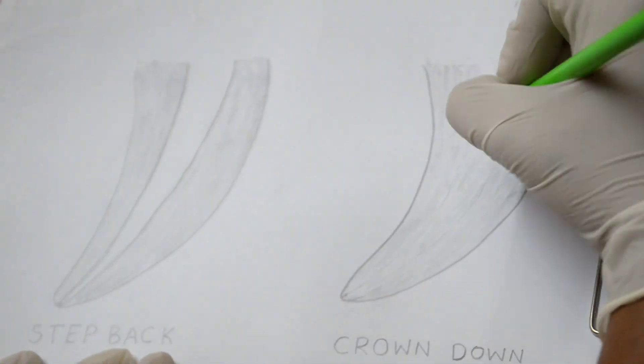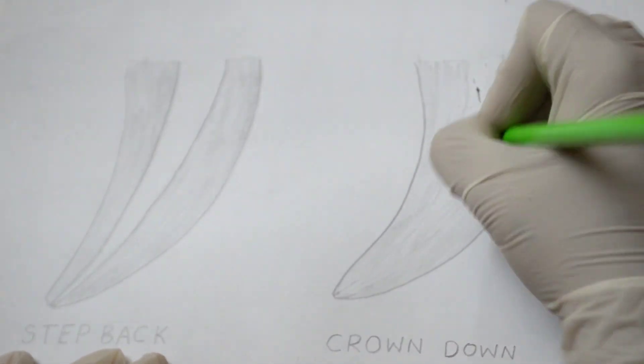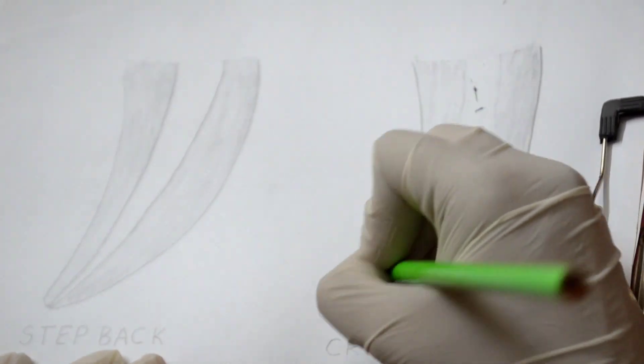While the concept of first instrumenting the coronal one-third of the root canal before apical shaping is known as crown down technique.